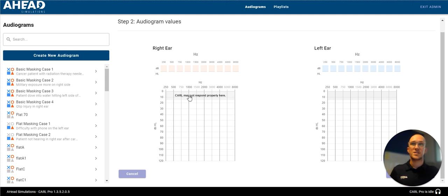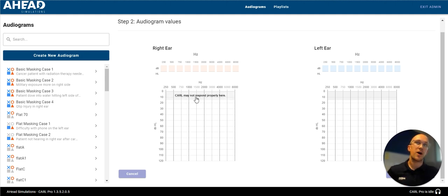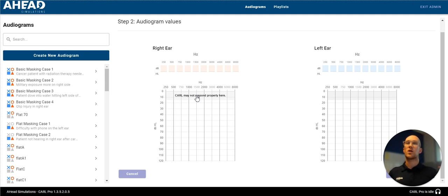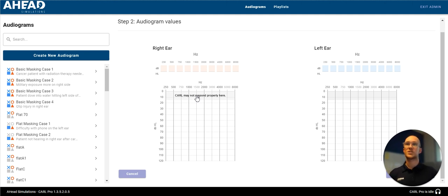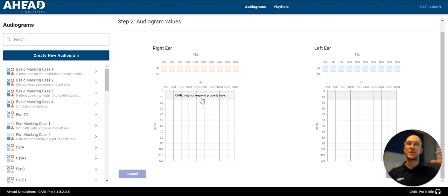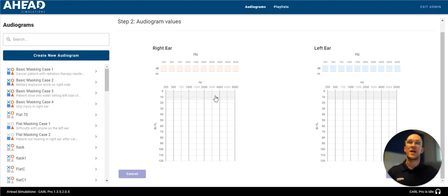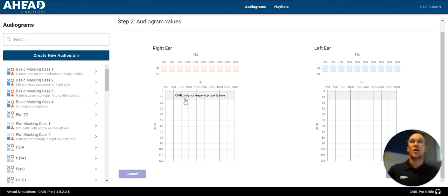You can see there's a shaded region here that says Carl may not respond properly here. This is because these were our measured values for the noise floor during our calibration step. So it's keeping those values in mind. And it's telling you that if you place thresholds here, Carl may not respond properly.